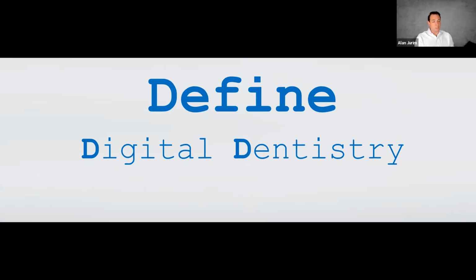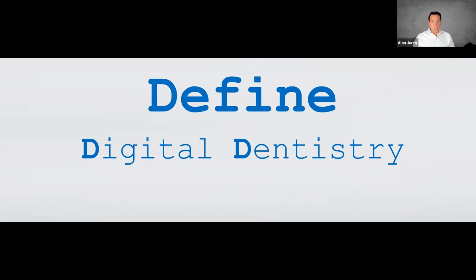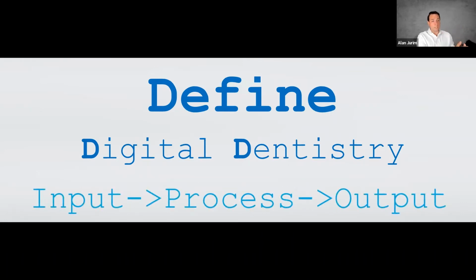You should really think of digital dentistry in 3 different key categories. I call it IPO dentistry now, or really thinking as an engineer, it's really inputting information, how we process that information, and then how do we share, how do we output that information? And those are the 3 main categories of digital dentistry that we can use on a daily basis. And you should really think about those categories into what you feel most comfortable, as you want to bring this into the practice.